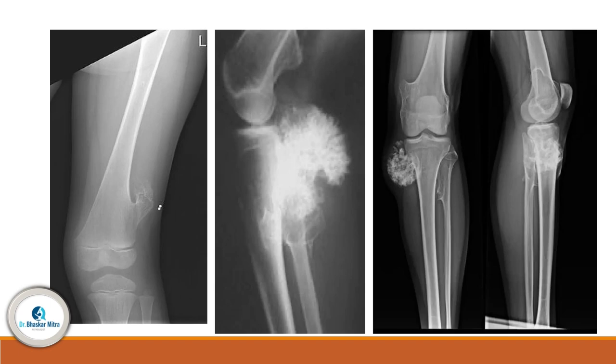So what we can see is the bone is growing in this way and it's growing in another way. So there is a defect in the growth direction, as the bone is supposed to grow in this way, but it is not growing, it is growing in another way. It is a misdirected bone growth, what we can say roughly. This is in the tibia showing osteochondroma, polypoid mass areas.